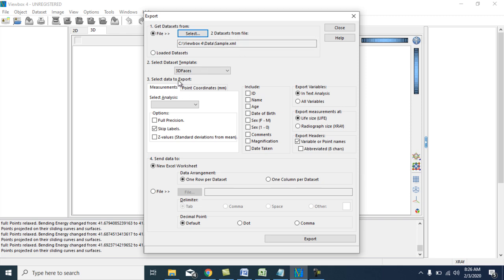Okay, just to show as a sample. Our database is the default. Don't forget, if not, you can select from here. Then here, this is the fixed point. We have to do the fixed point first. Don't forget, that's the starting point. Click on ID, then click on export 3D coordinate.